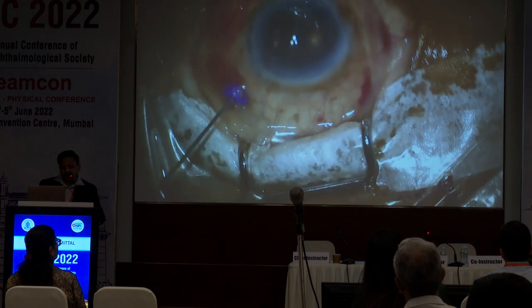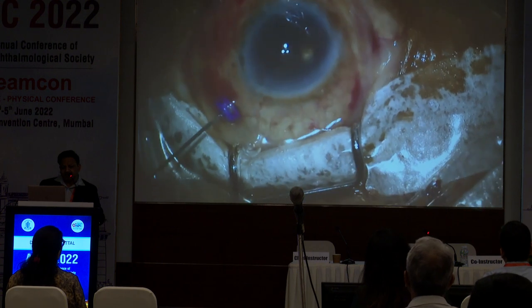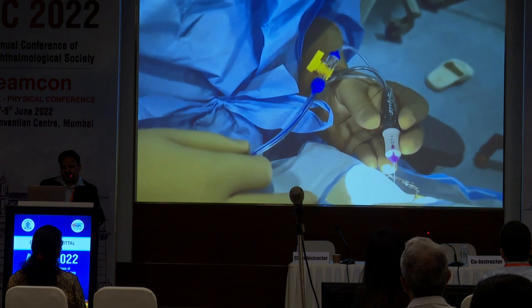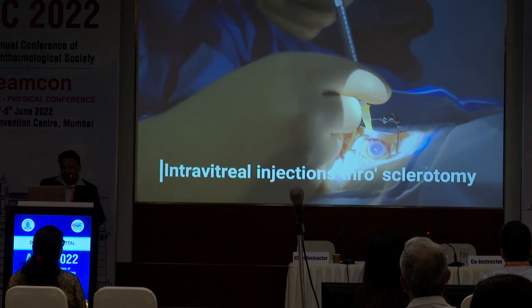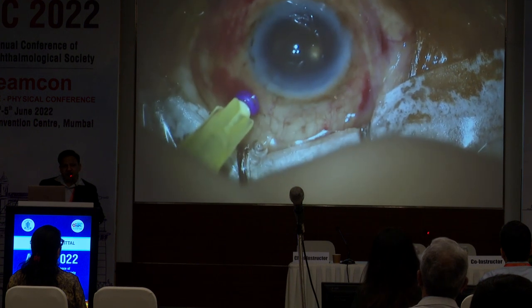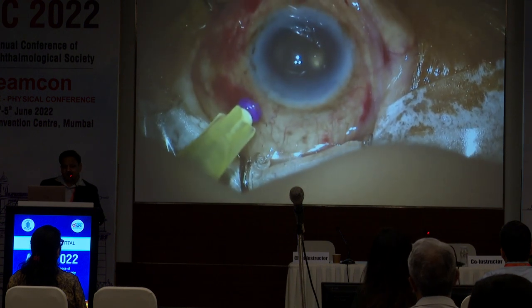The fluid in this case collects into the tubing. You see, it's getting collected into the suction tubing. And now, to counteract the hypotony, we give the intravitreal injections through the same sclerotomy port that we have created.